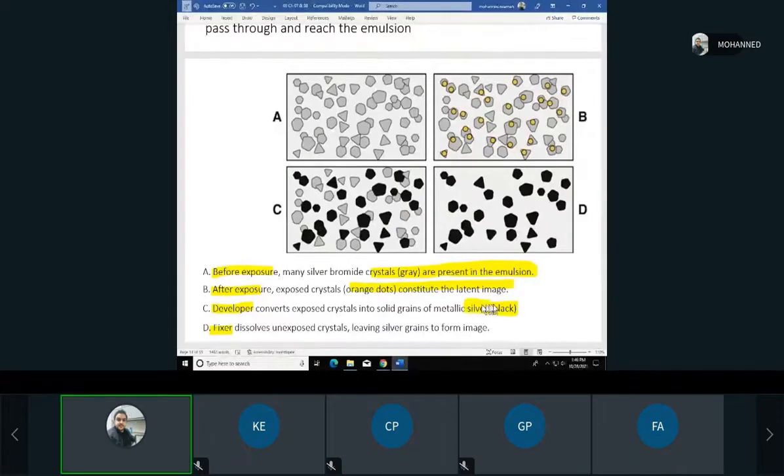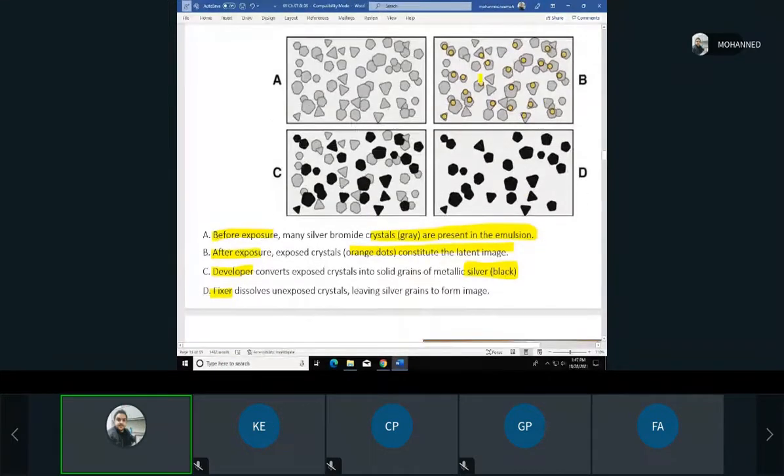Because when the X-ray hits the film, it will turn what? Black, right? The parts that are not hit by X-ray are the ones that are gray and the ones that are white. Correct? Yes. If you just had a film and you expose it directly, it will appear all dark, right? All black. So that's why, again, only the ones that are exposed by the X-ray will turn black.